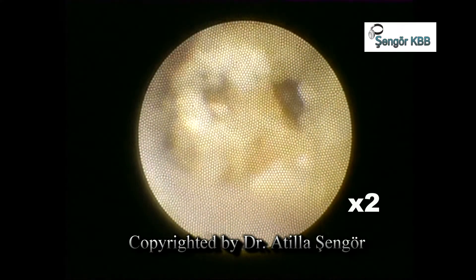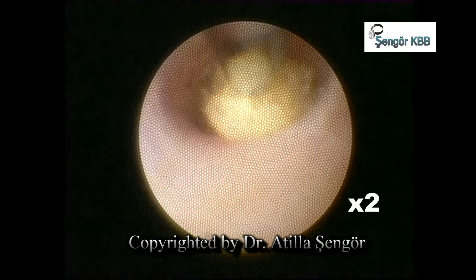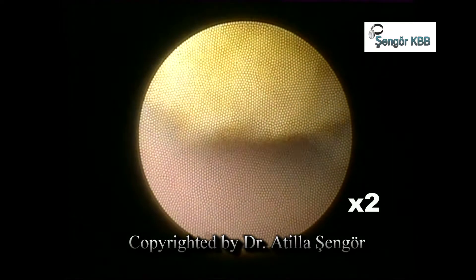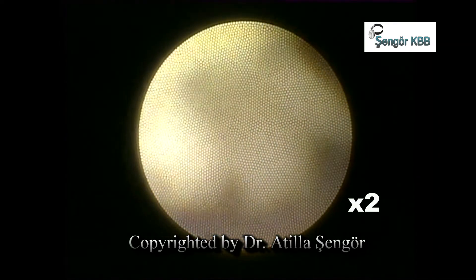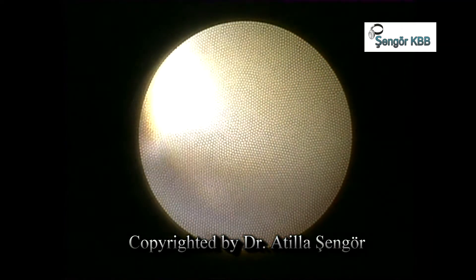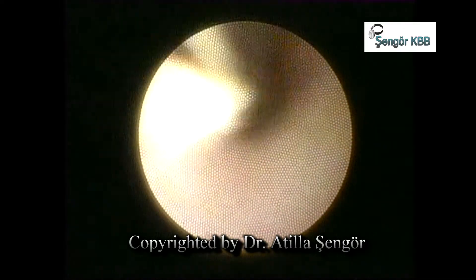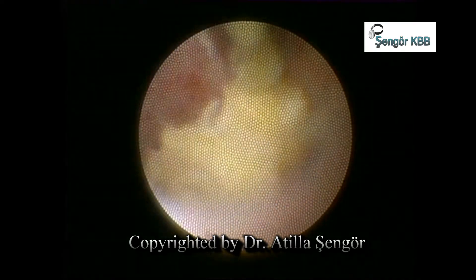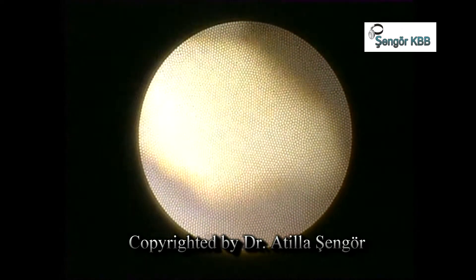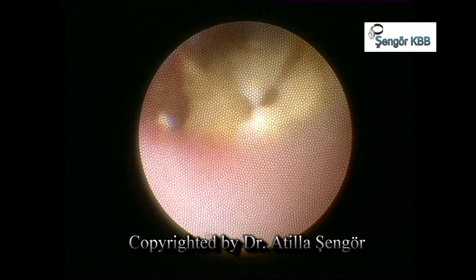The current treatment algorithm for this kind of stone recommends intraoral surgery or gland removal. I started sialendoscopy in 2004 and have been removing large stones this way since 2007. Since the fragmentation is pneumatic, air pressure does not cause heat damage. It may seem easy watching here, but as we Turks say, it is like digging a well with a needle. It requires years of training, lithotripsy equipment, advanced sialendoscopy experience, and most importantly, determination and patience.